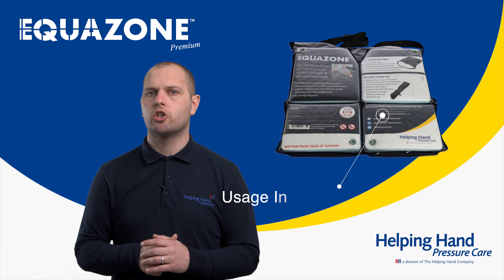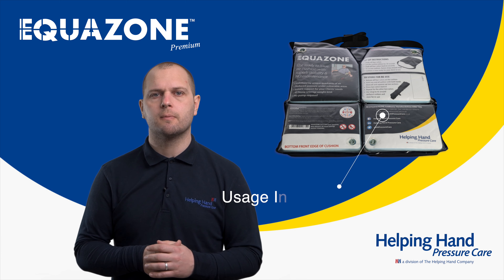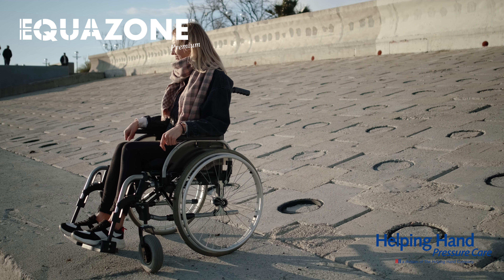On the underside of the cushion there are cleaning instructions for the core of the cushion, fire retardancy standards, and all other regulations. The Equizone Premium can be used on a wide variety of chairs but mainly for wheelchair users.